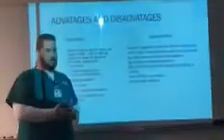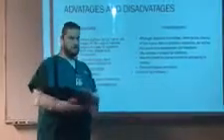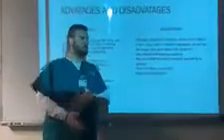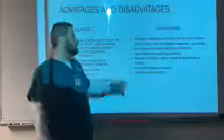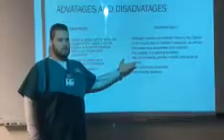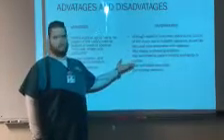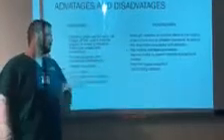Also there may be overlapping anatomy, like when the patient is lying on their side, you'll see that their intestines are overlapping, so you have to position them in a way where you can see the anatomy that needs to be seen. It's very limited patient mobility and ability. If the patient can't move, it's very difficult to get the image that's required. It also shows poor soft tissue resolution and is also an ionizing radiation.